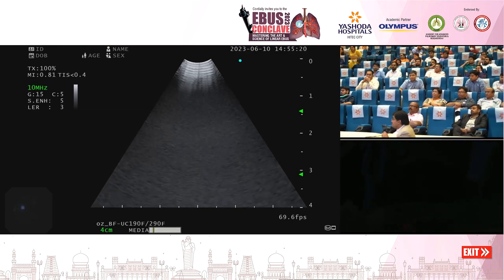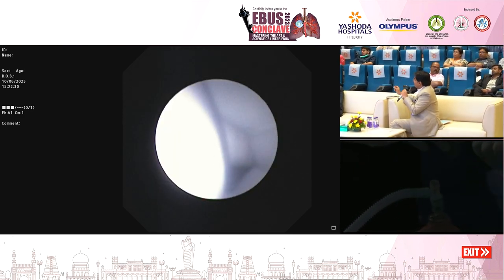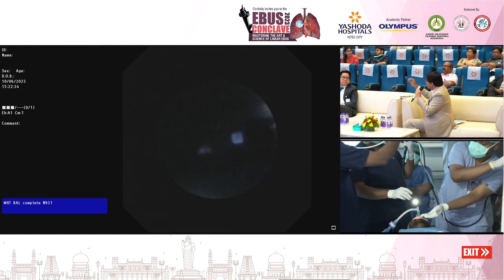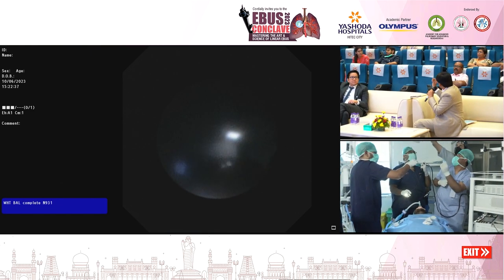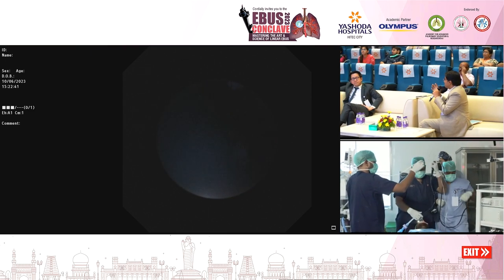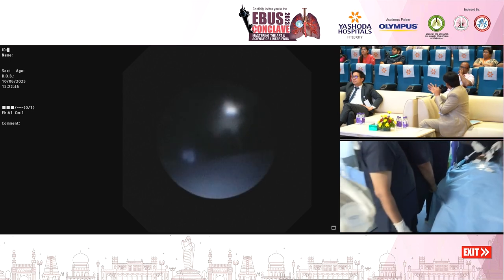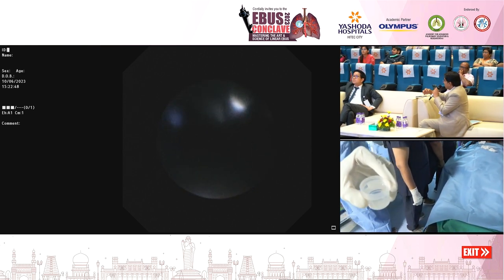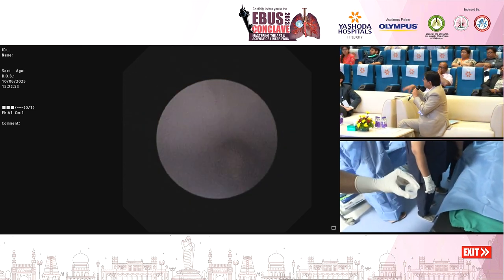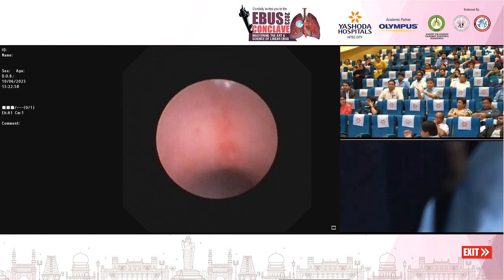On endoscopic vision, it is not essential that you always see a big opening unless you push the sheath, like Dr. Tikbar has said. If you push the sheath inside, then obviously the opening is bigger. Here they use the 19G needle. The main thing is to remember where you have actually gone inside. Fix the scope in that location and don't change. The moment the 19G needle is out, you put the cryoprobe inside, so you don't have to move around too much. With the scope fixed, you know where you punctured.